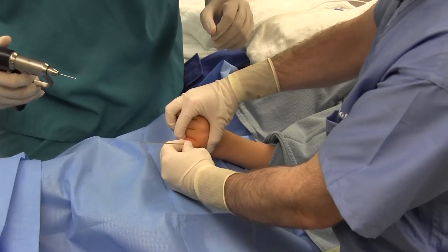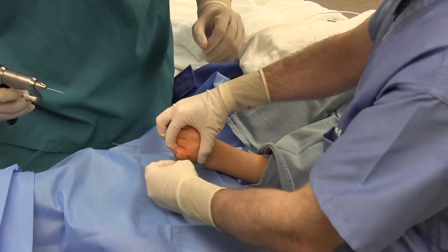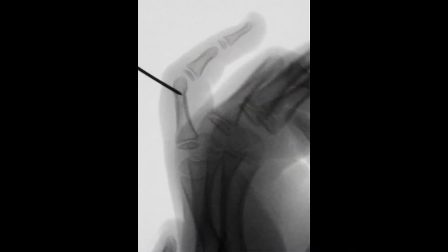At the time of surgery, the fracture was not reducible. Osteoclysis was performed using a .045 k-wire placed into the fracture to manipulate the reduction.